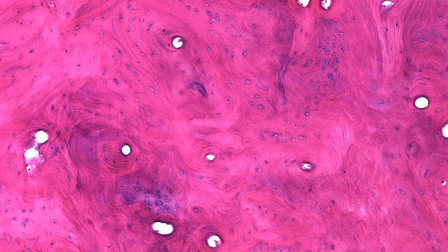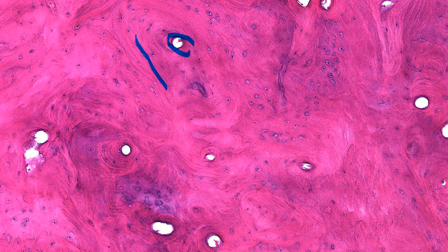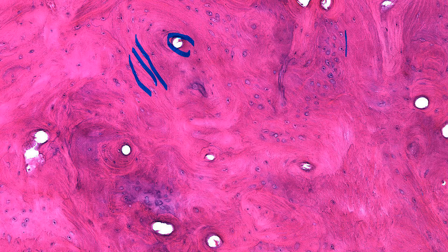Histologically speaking, this is a very easy diagnosis because it is made up in most cases of mature lamellar bone. Specifically, it looks like cortical bone in the sense that it has haversian canals with osteocytes embedded in the bone. Notice this very lamellar bone. You could mistake this for normal cortical bone, except there is a bit of remodeling going on, so the canals are not placed quite right.